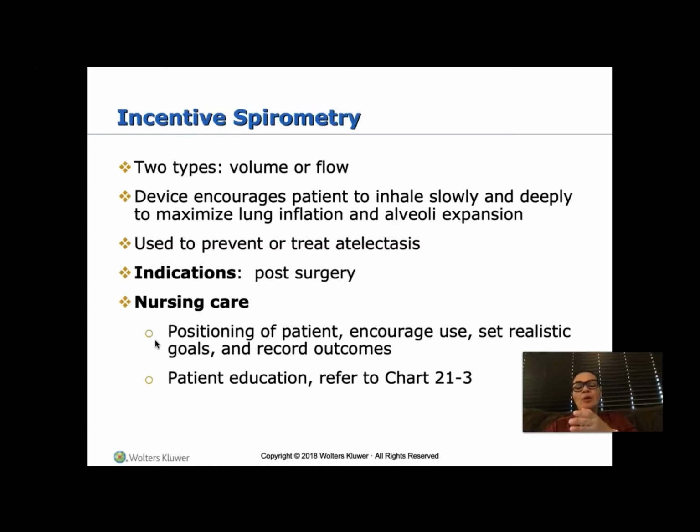Incentive therapy, incentive spirometers are given right after surgery, when we walk in the hospital, for any kind of procedure. It helps what? Practice to what? Expand and open those lungs to prevent any kind of issues that we would need a CPAP or a BiPAP or anything like that, okay? If we are laying down more, we're not taking those deep breaths we need. If our activity level has decreased because we are not feeling well, by doing it when we are awake at least 10 times, we're giving those lungs the workout it needs.